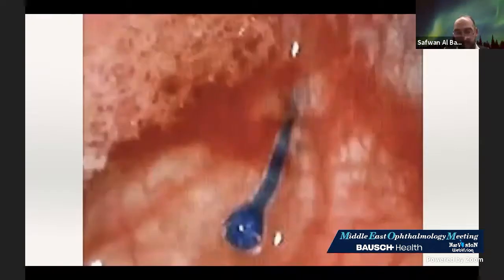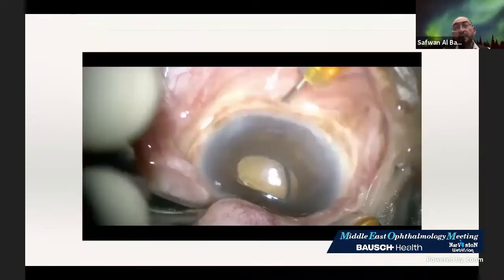Now I will go to the hinge. I will go to the movie without double needle. Now this lens is in, and I decided to skew that lens and rescue that lens, and that's the movie of how it works.